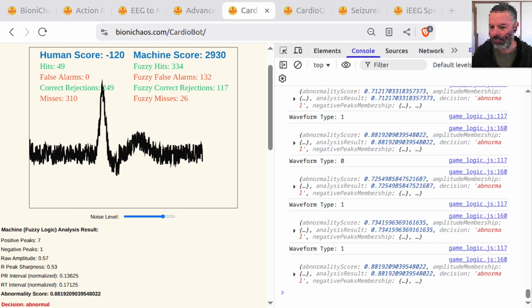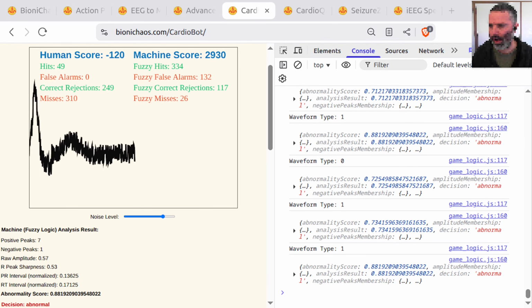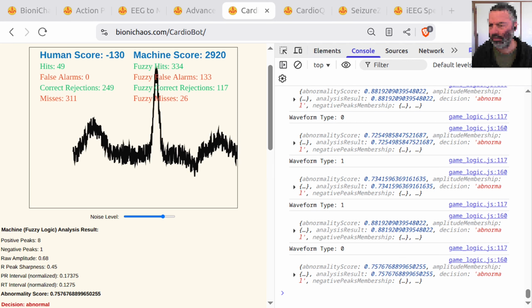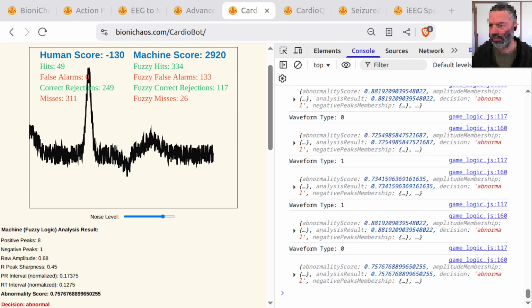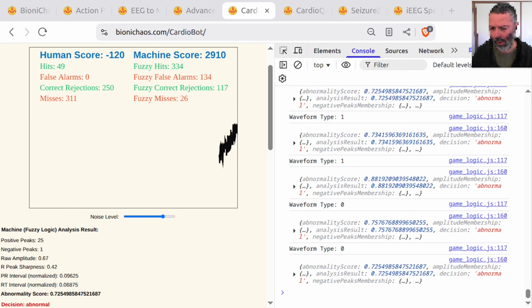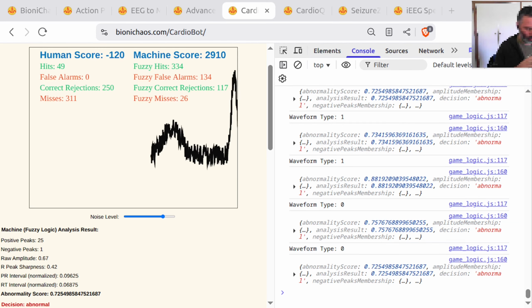Is the ECG waveform data array normalized before being drawn? Example, scaled to fit between -1 and 1, then mapped to the canvas coordinates. Guarantees that the waveform looks correct regardless of the raw voltage range in the JSON data, ensuring accuracy and stability across different pathologies. CSS box sizing.